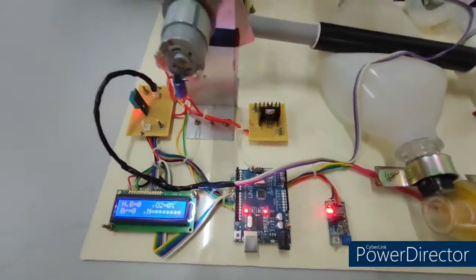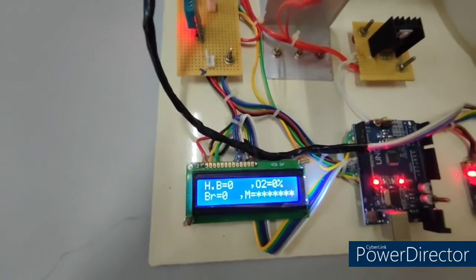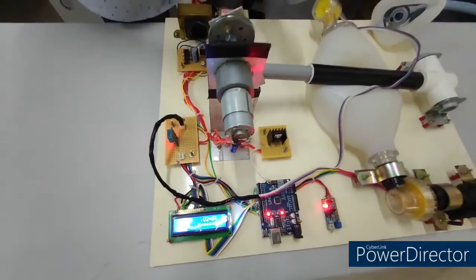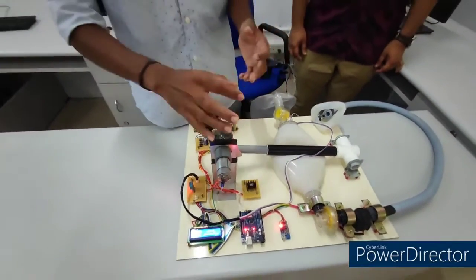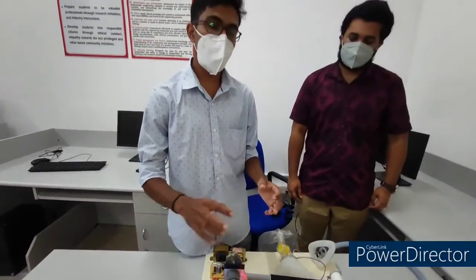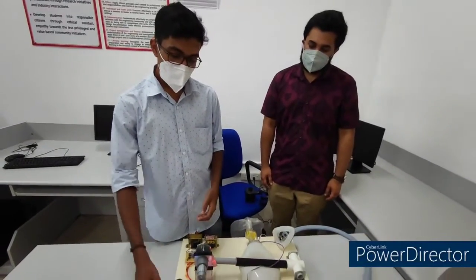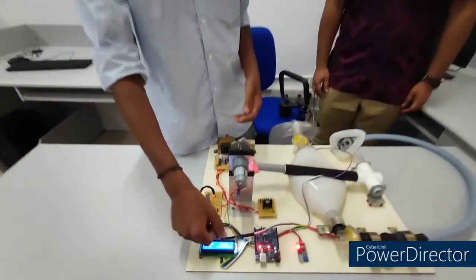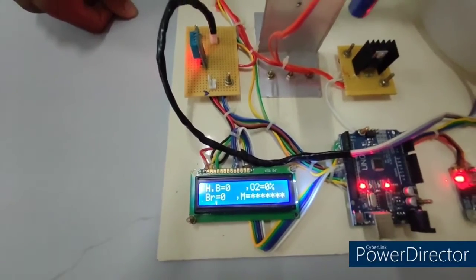According to the heartbeat values, we have arranged three operating levels. Below 50 BPM, the mechanical ventilator does not operate because it indicates a low pulse. Above 50 BPM, it works at medium speed. Above 90 BPM, it operates in passive mode, meaning high speed — above the medium level. On the display, we can read both the heartbeat value and the oxygen percentage.